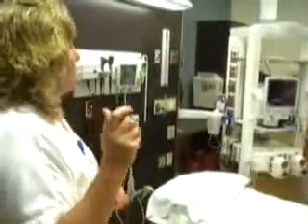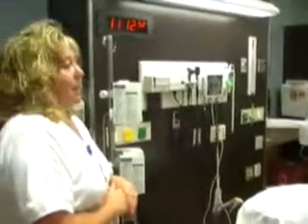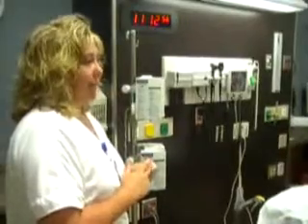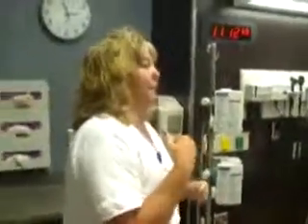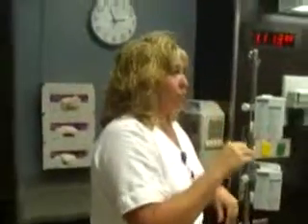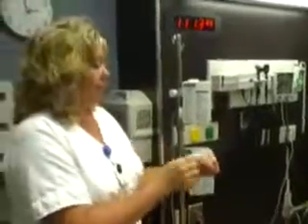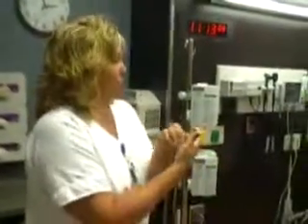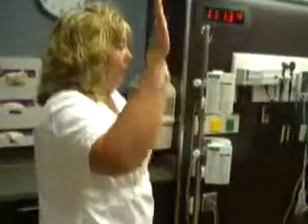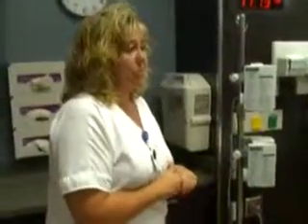The lights are the same as, or similar to that used in an operating room. The lights are meant to be used for fine detail work, such as suturing or exploring wounds. They can be focused to an area as little as the hole in the top of my hand, and they can be made as big as the patient themselves. They produce an ambient heat, which also keeps the patient warm, because trauma patients need to be kept warm.